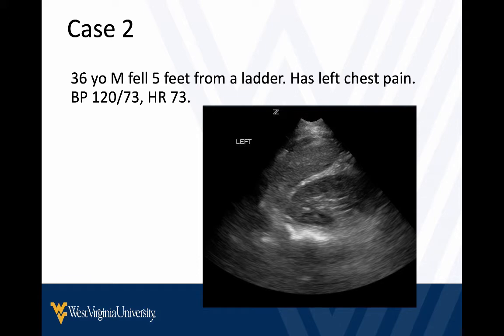And this is our second case. This is a 36-year-old who fell from a ladder, has left-sided chest pain. And again, probably some subtle findings. These aren't nice crisp lines here, but it's really tough to make a definitive call with that single image.